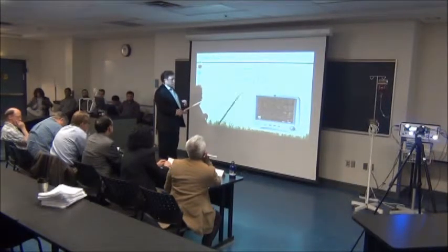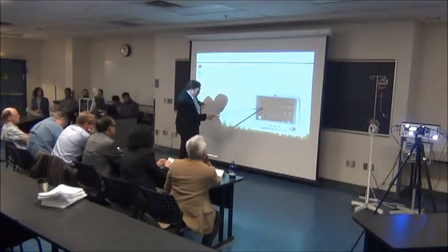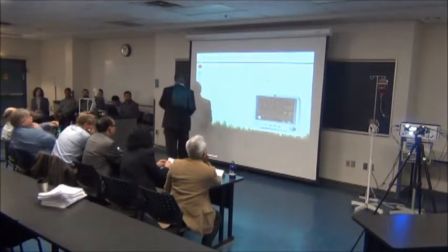Here's a commercial vital sign monitor, and you can see, maybe you can't see it, but right here is the invasive blood pressure. And this one is 132/73.